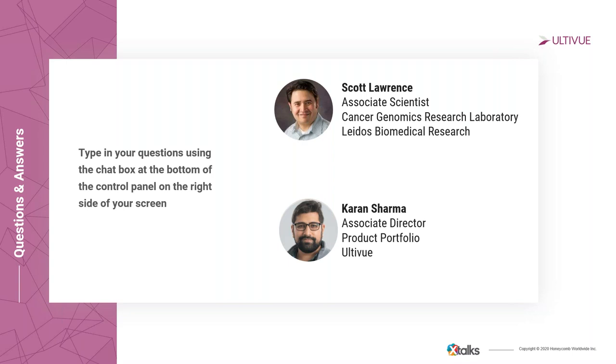Thank you. Our next question is, how can you run the H&E without interference between eosin and fluorescent dyes? Yep, that's a good question too. The reason you don't see that interference is because we're doing the immunofluorescence stain first and then capturing that image. And then after that, we're doing an H&E and running a bright field scan. If we were to do the H&E first and then the InSituPlex assay, then yes, the eosin would be picked up in that fluorescence scan, but it's because we're doing the InSituPlex assay first.